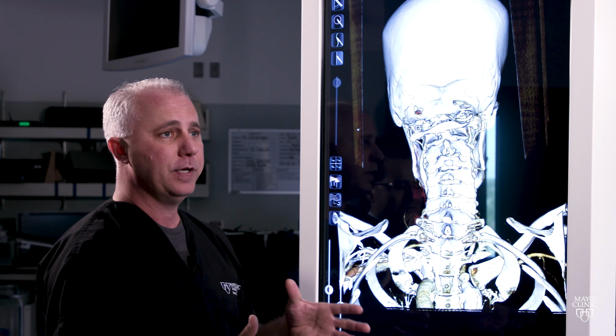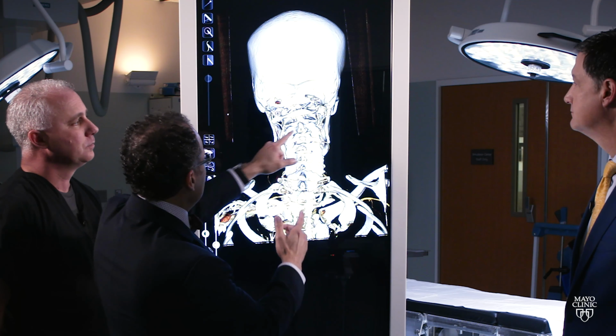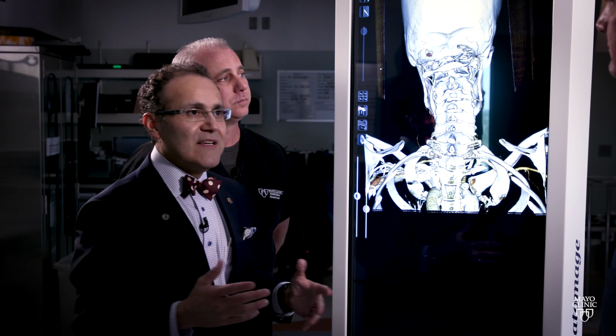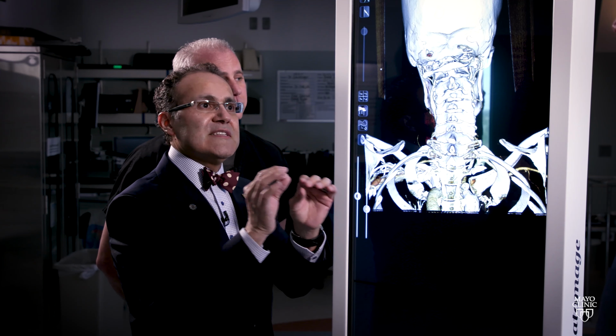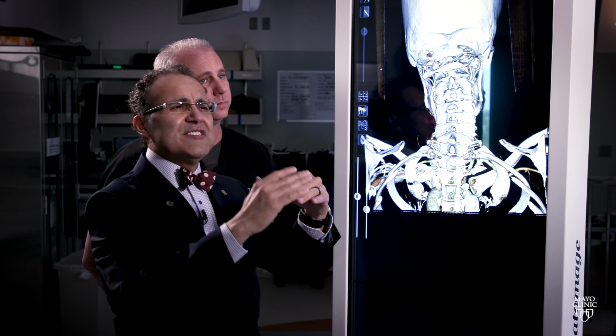All right, so Dr. Q, come in and tell me what you see or why this makes a difference in treating people who have issues. Well, thank you, Ken. First of all, I think that Conrad did a beautiful job explaining not only the extraordinarily complex anatomy, but then you simplify. You can actually see the bone, you can see the blood vessels, and in this particular case, the patient, they couldn't find what was going on. They said every time you turn to one side, you faint. People said that doesn't make sense. Right. But it was not until we brought the patient, we did a very specialized scan with what we call thin cuts. Instead of just a regular scan, there's about 30 cuts. These are hundreds of cuts.